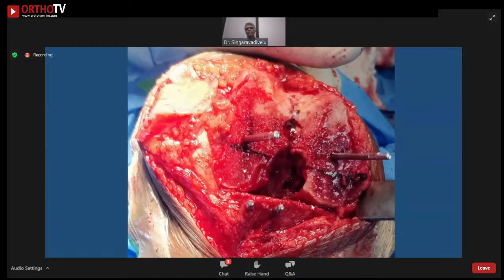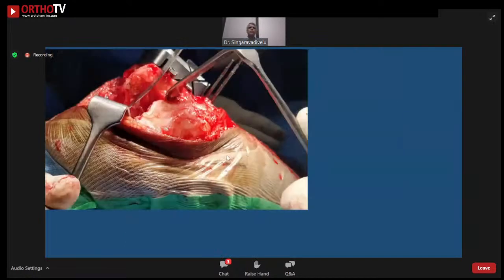This was a varus knee which I did recently, a week ago. Even though it is a varus knee, this is the epicondylar axis I marked, still it means that there is more external rotation. If the external rotation is more, you can see that there can be an anterior notching. Once it is pinned, you can see that there is an anterior notching, and it is the worst result you can get.